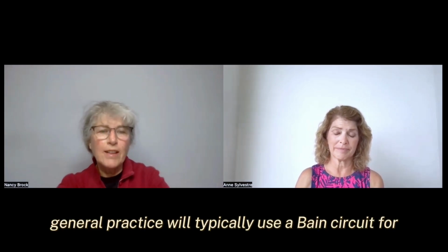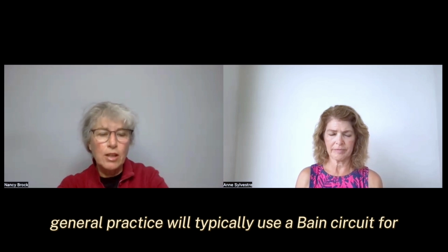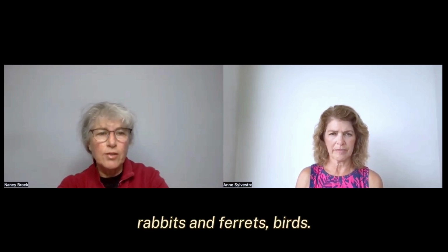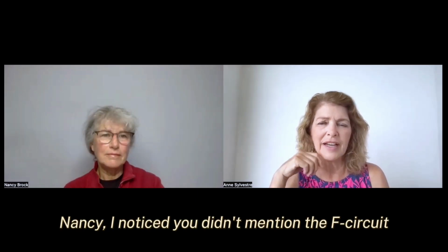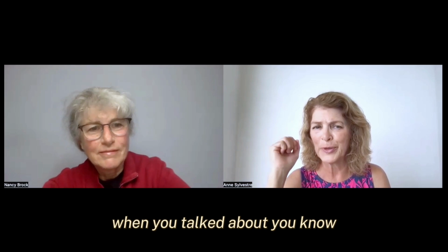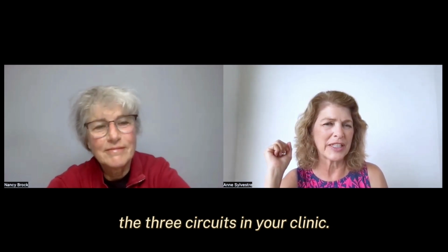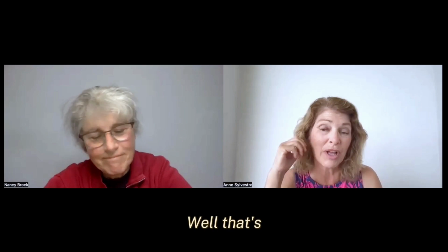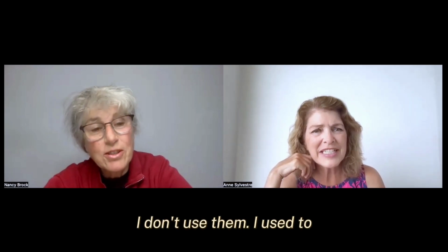But, you know, a general practice will typically use a Bains circuit for puppies, kittens, rabbits, ferrets, and birds. Nancy, I noticed you didn't mention the F circuit when you talked about the 3 circuits in your clinic. Yeah, I don't use them. I used to.